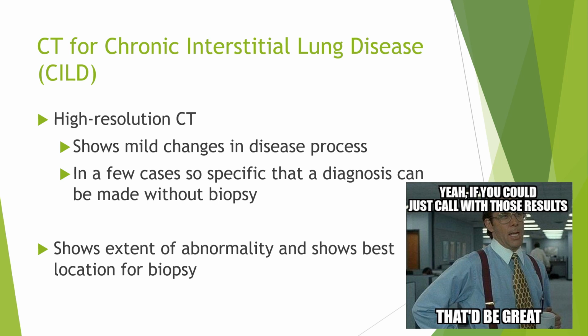What about CTs in ILDs, right? Remember, there's over 200 different types of ILDs, and high-resolution CTs will show mild changes. In other words, we're going to see a lot more detailed picture of the disease progress, and so therefore we could look at the prognosis and the time frame of different things that are going on with the patient, especially if, in some of these cases, they see the honeycombing pattern and all those things, they can actually make the diagnosis of ILD without a biopsy.